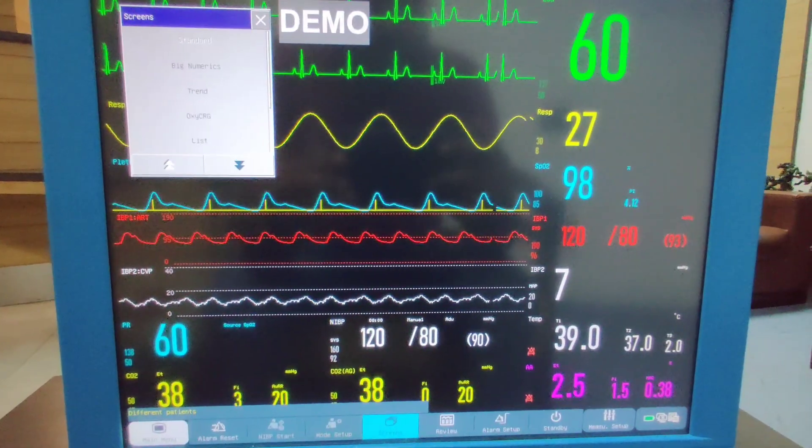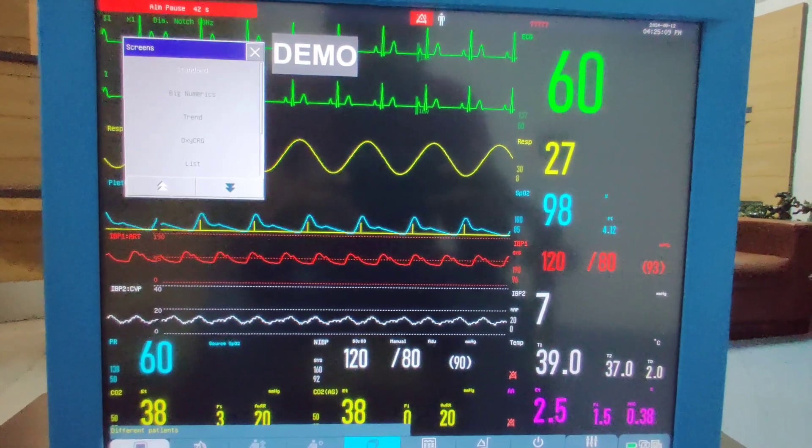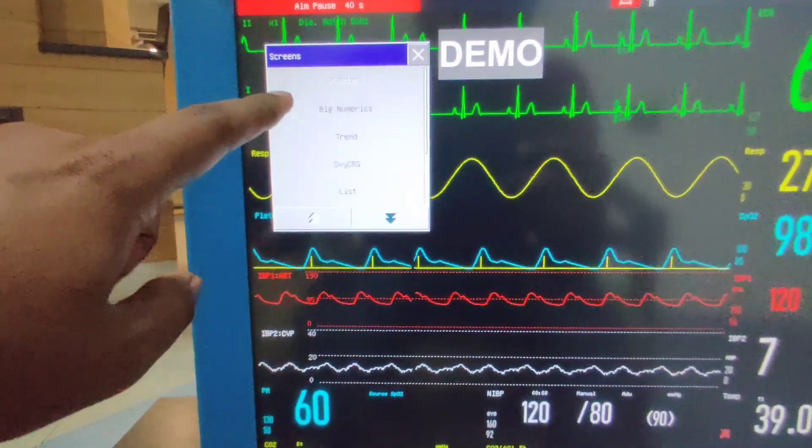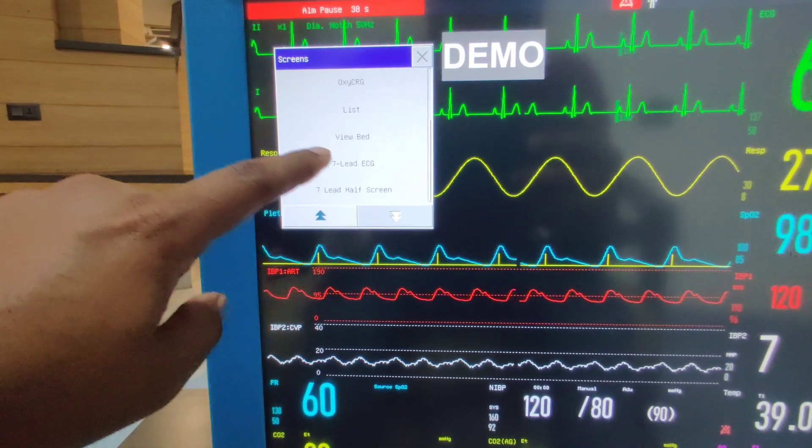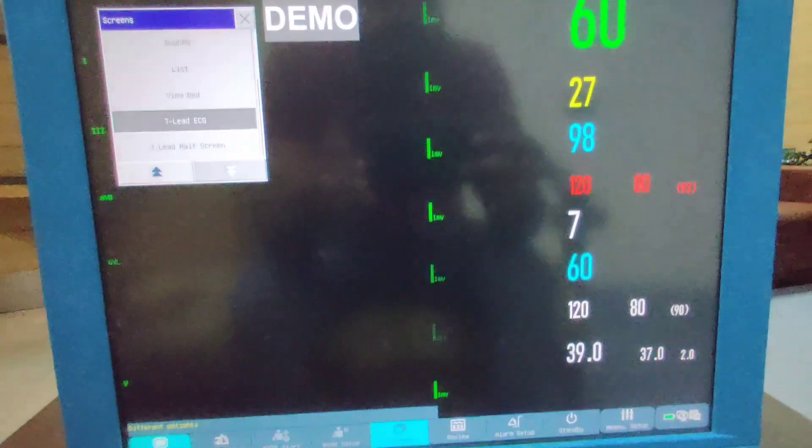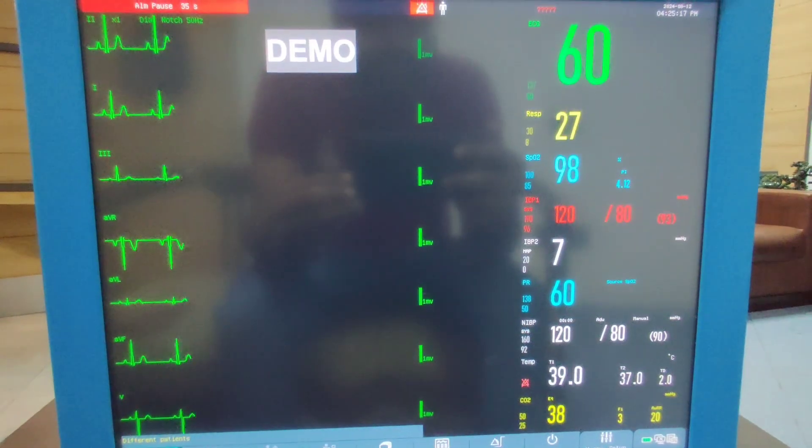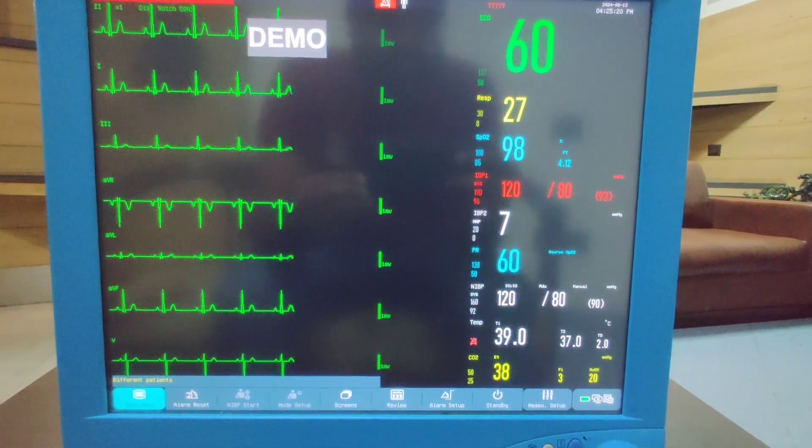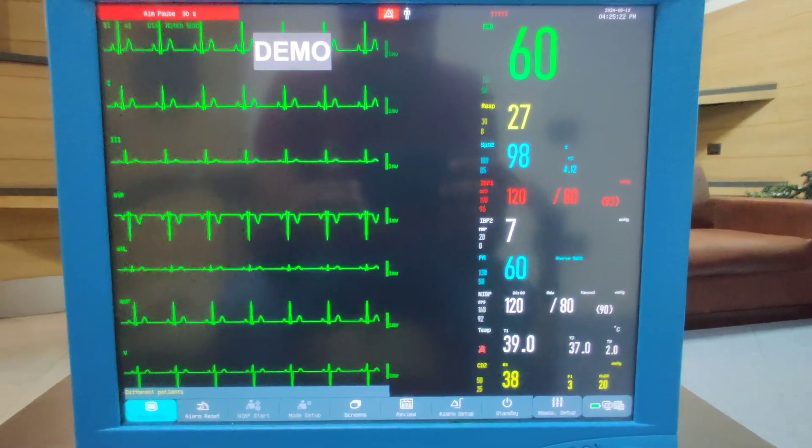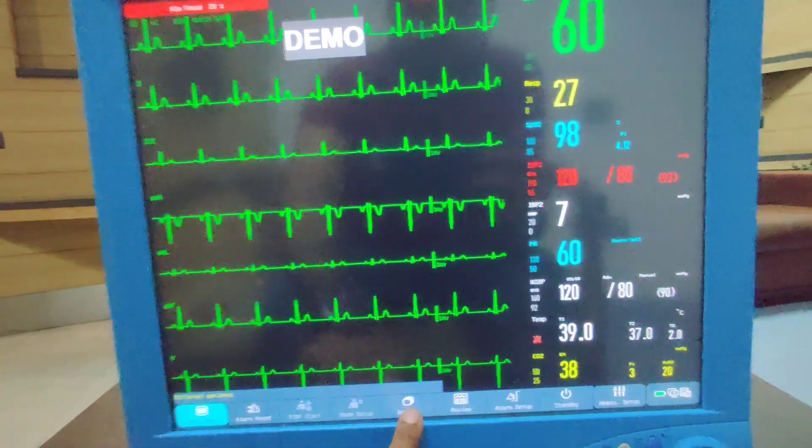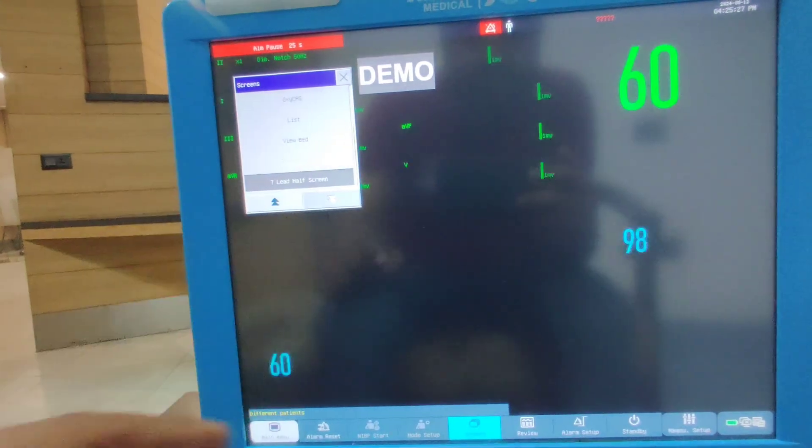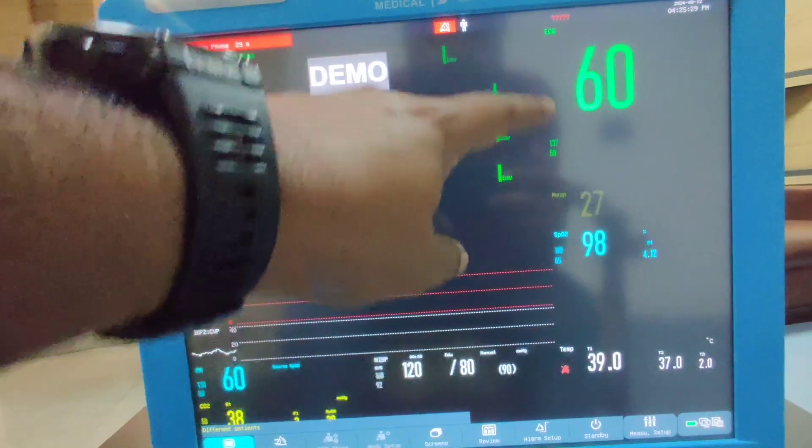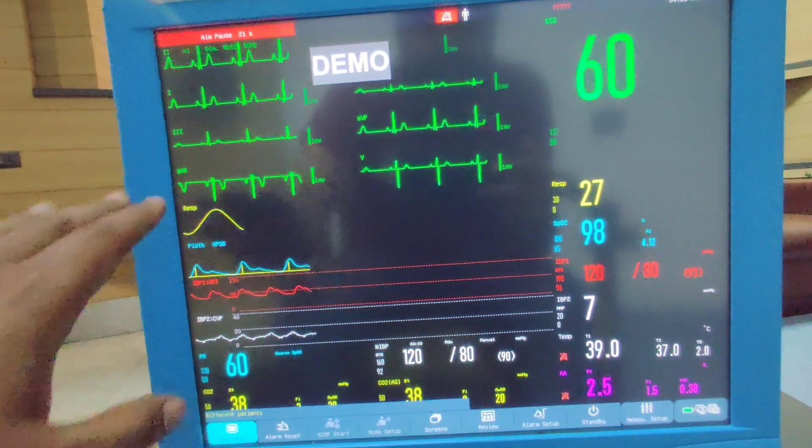We have preset pre-configurable screens: big numerics, trend display, oxy CRG list, and we can have all seven leads analysis or seven leads waveform on single display wherein you'll be getting simultaneous display on all seven leads. Then we have the oxy CRG, then seven lead half wherein you'll get the half screen of seven leads and the rest of the parameters will be shown over here.